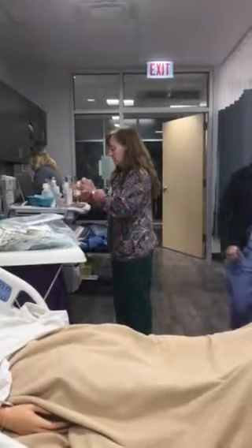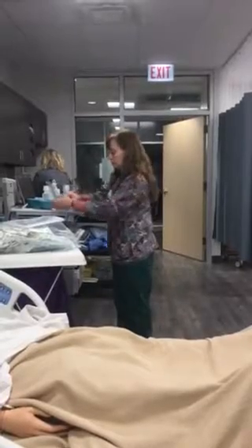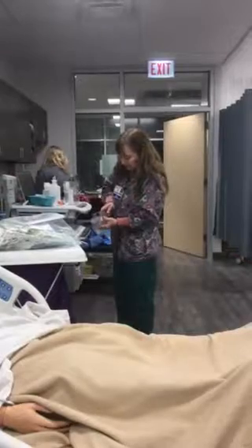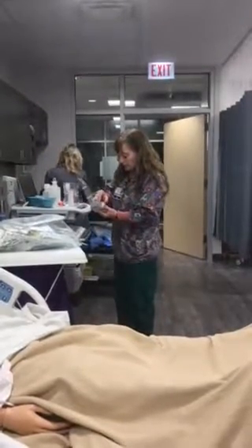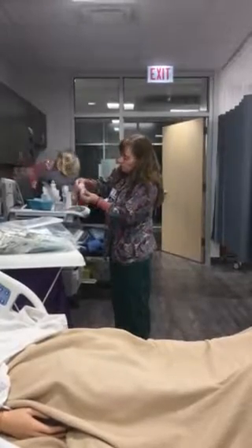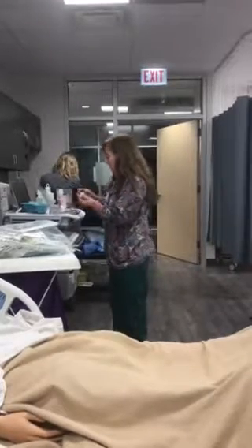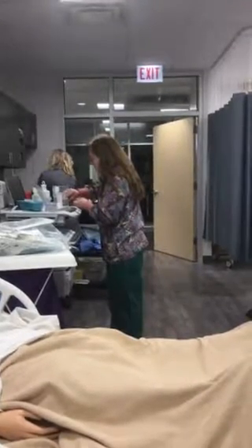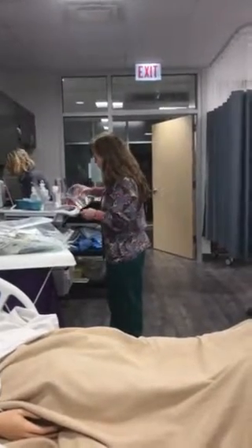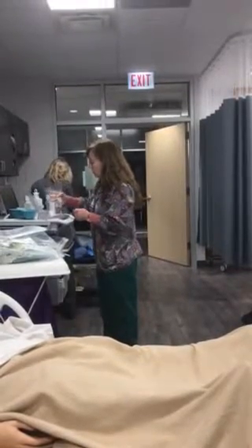So we're going to go ahead and take this out of the cup. Make sure none of it stuck to the bottom of the opposite cup, and this did not crush very well. Maybe it was off to the side. Much better. So again, we're going to make sure that nothing is stuck to the bottom of the cup. And then we will pour this into our cup. So we're going to use our free water again, and pour it into it. Again, 20 to 30 milliliters.